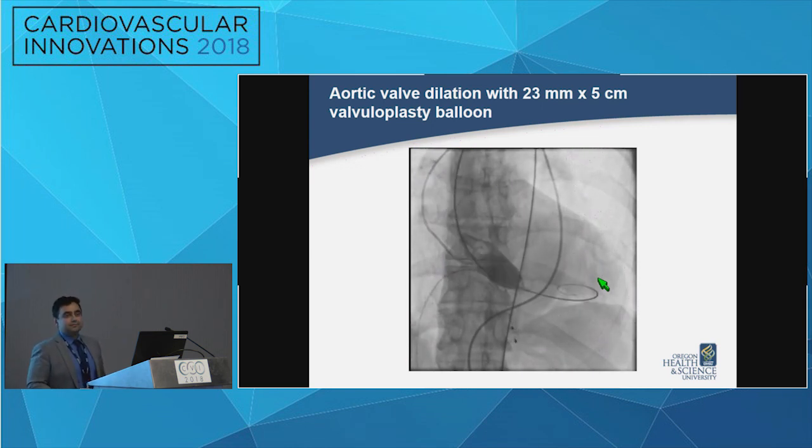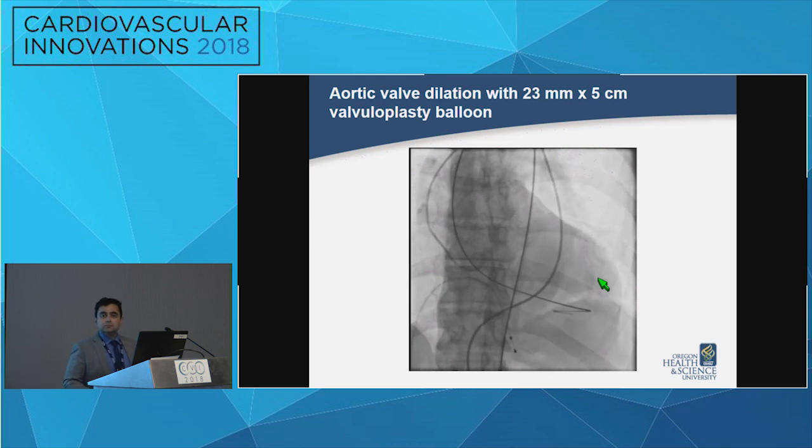How much oversized, out of curiosity? Because this 108 feels like only 4 or 5% oversized, for surgical. It is oversized, but I don't know exactly by how much.